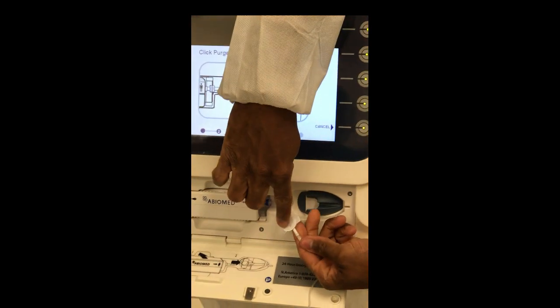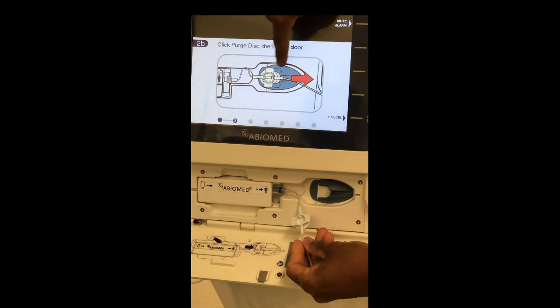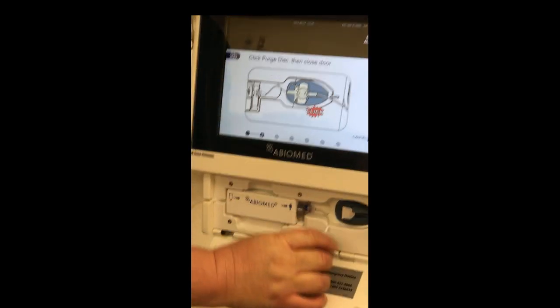Notice how the cassette has a membrane on one side and a finger slot on the other side. See how that matches up? It's telling you to place it here and slide it into this slot until it clicks.